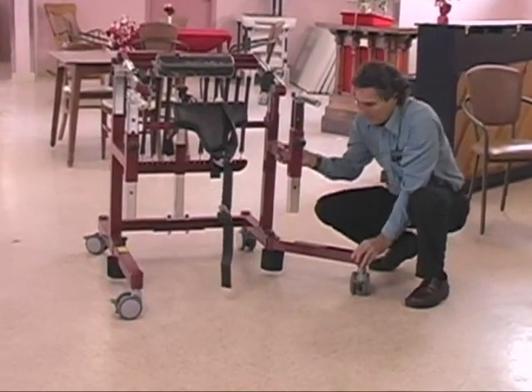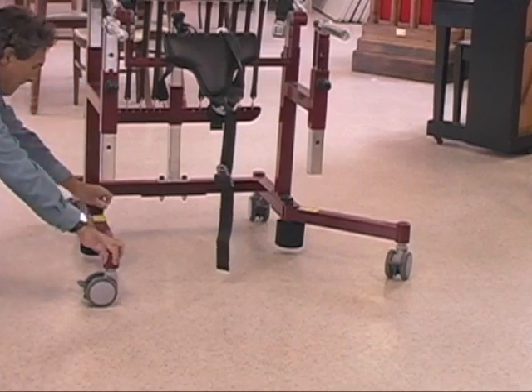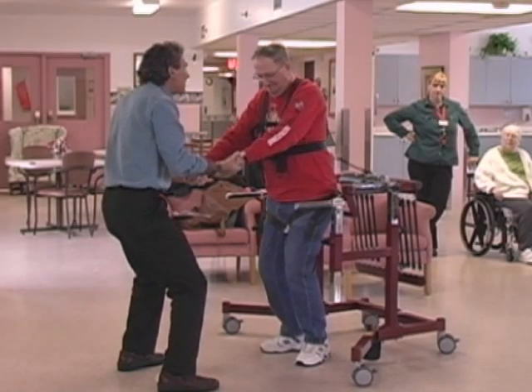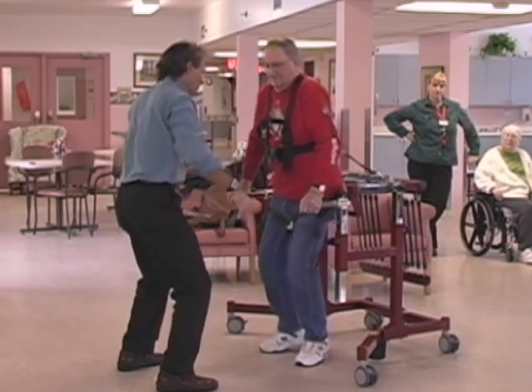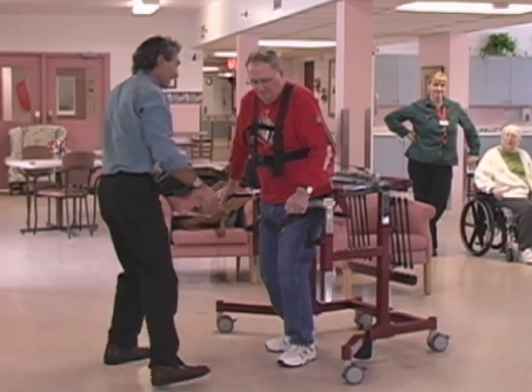The base of the Bungie Mobility Trainer widens to ensure mobility in all directions. This tool enables the training of high-level activities like jumping, hopping and landing with the necessary support from the bungee cords. Such skills, in turn, improve the person's stability in more basic functions such as walking.